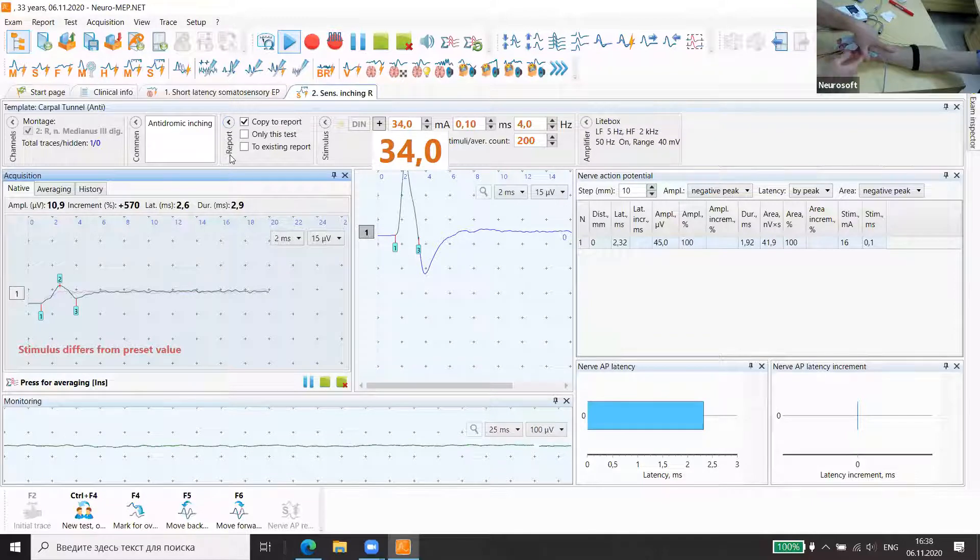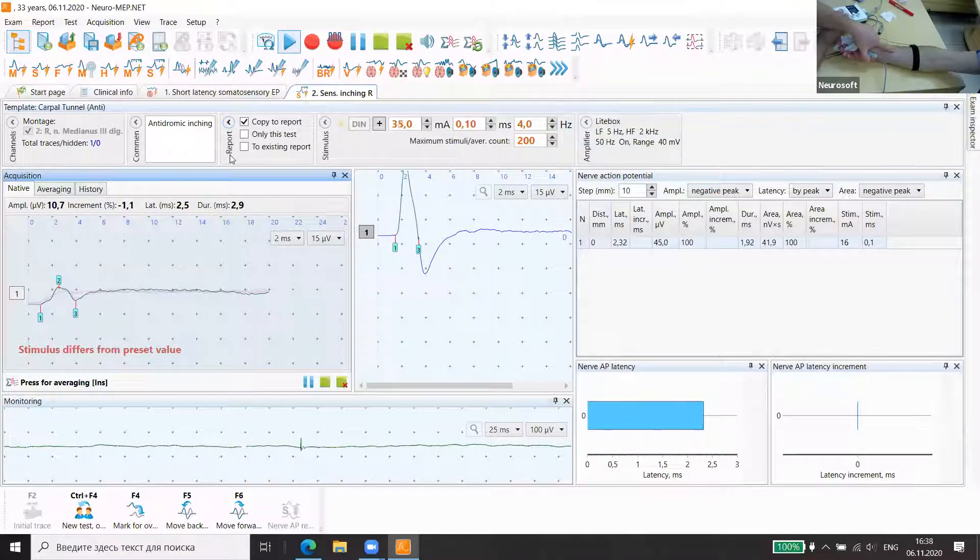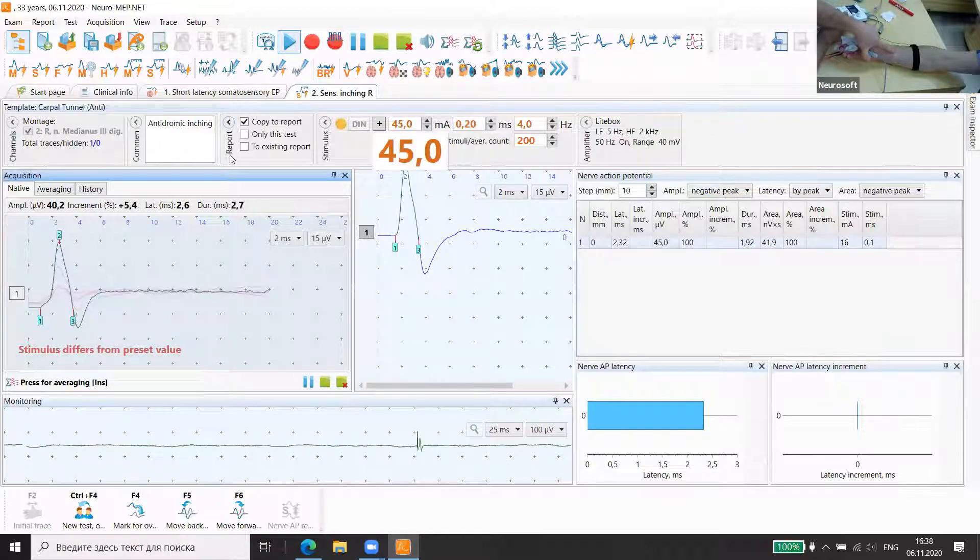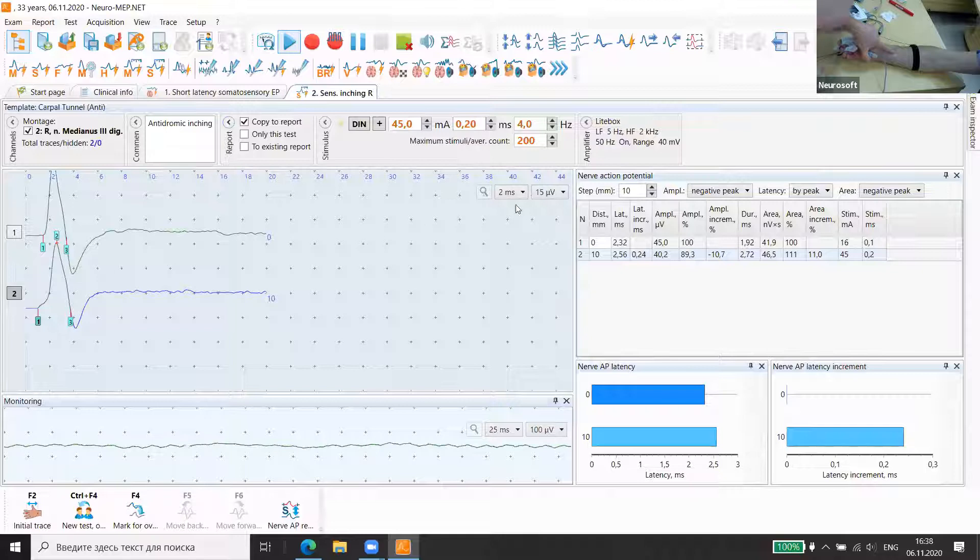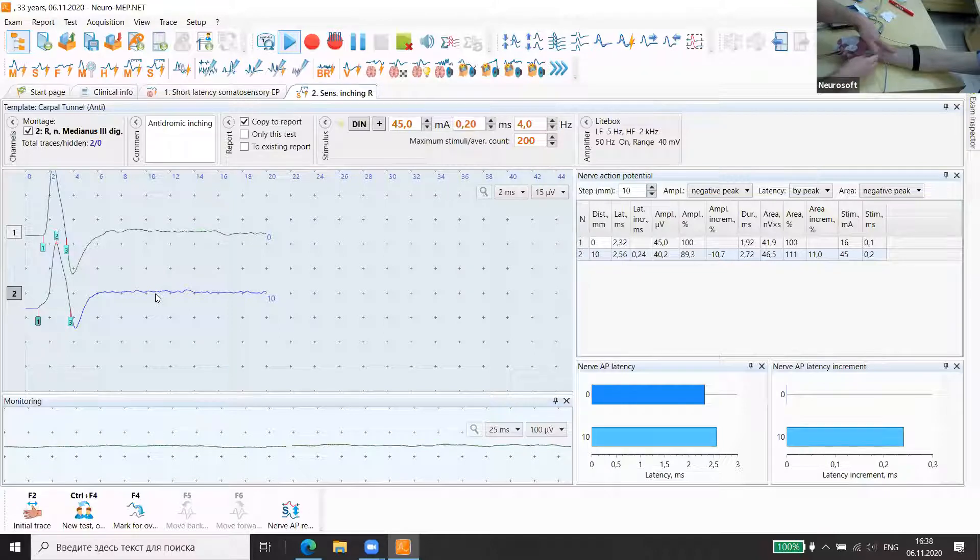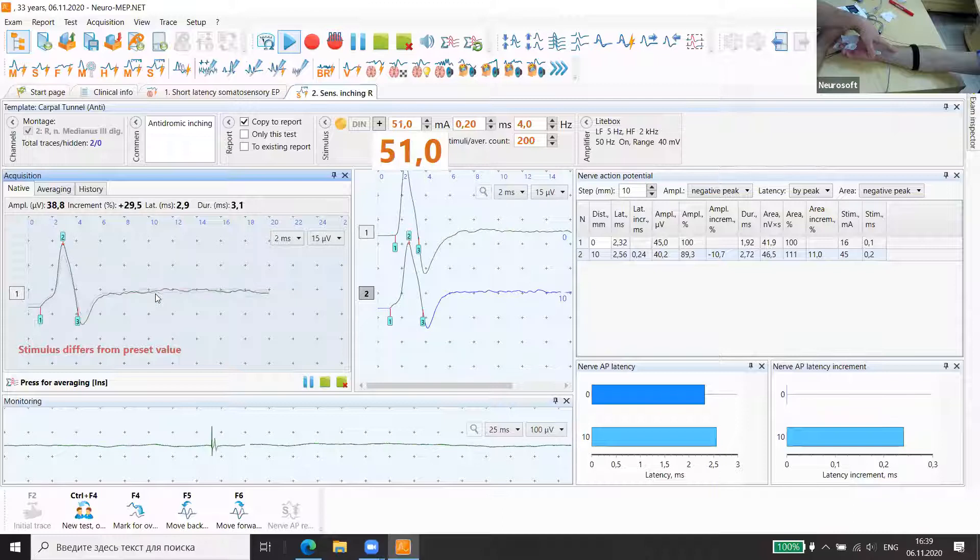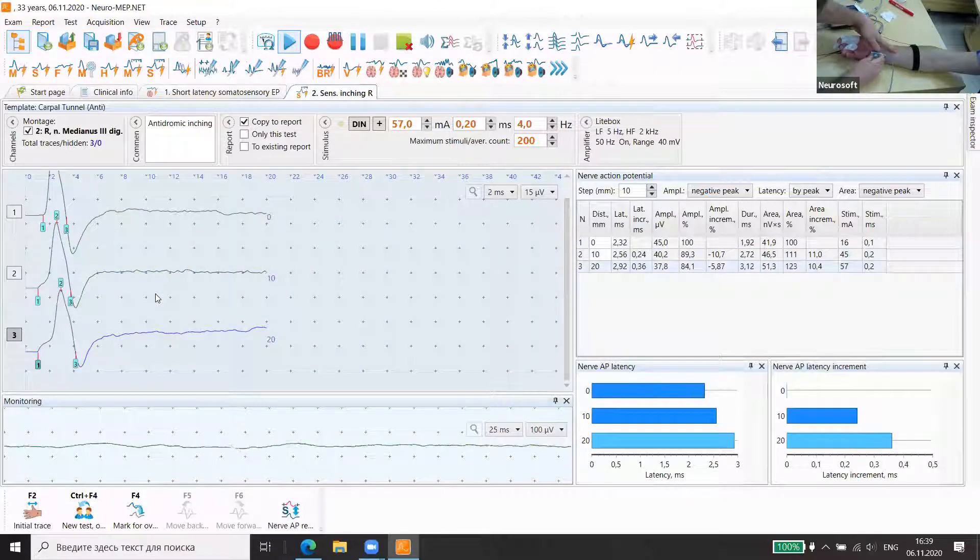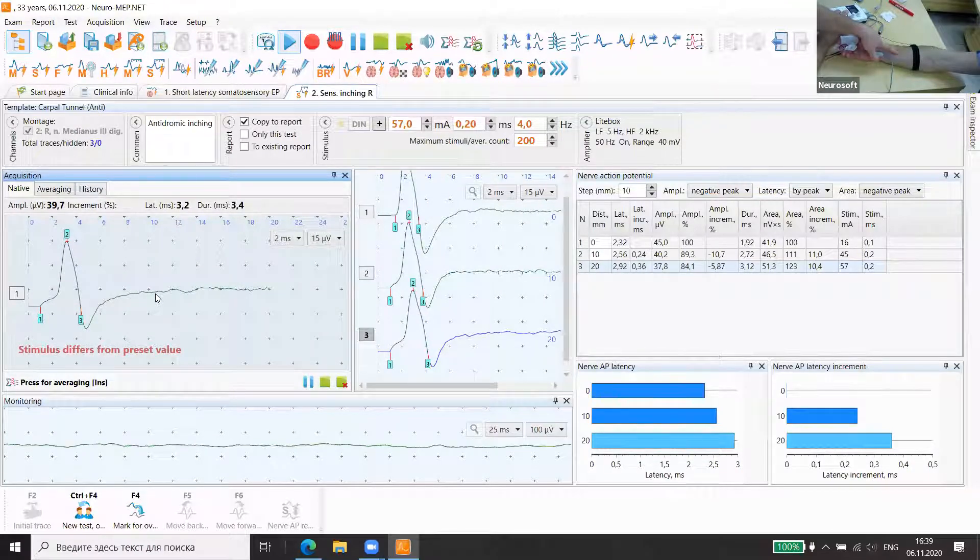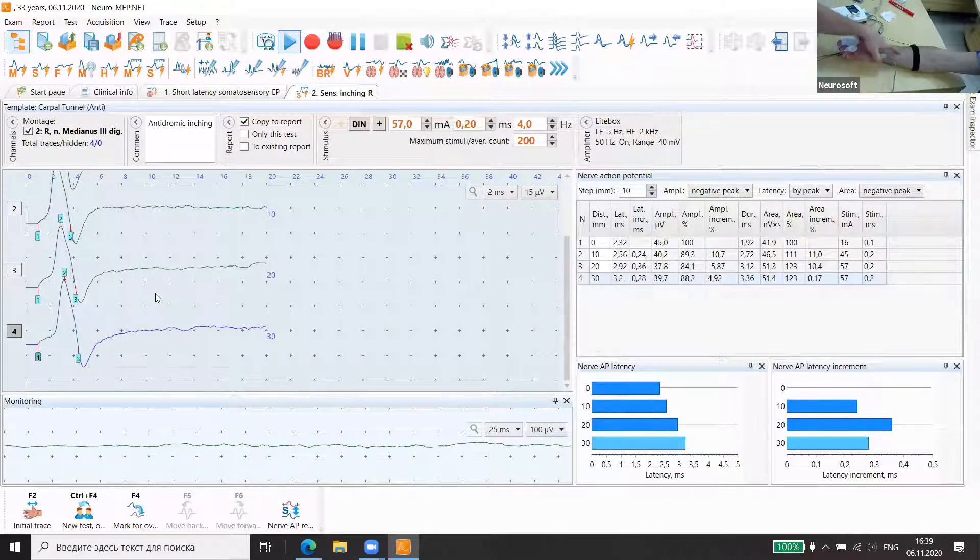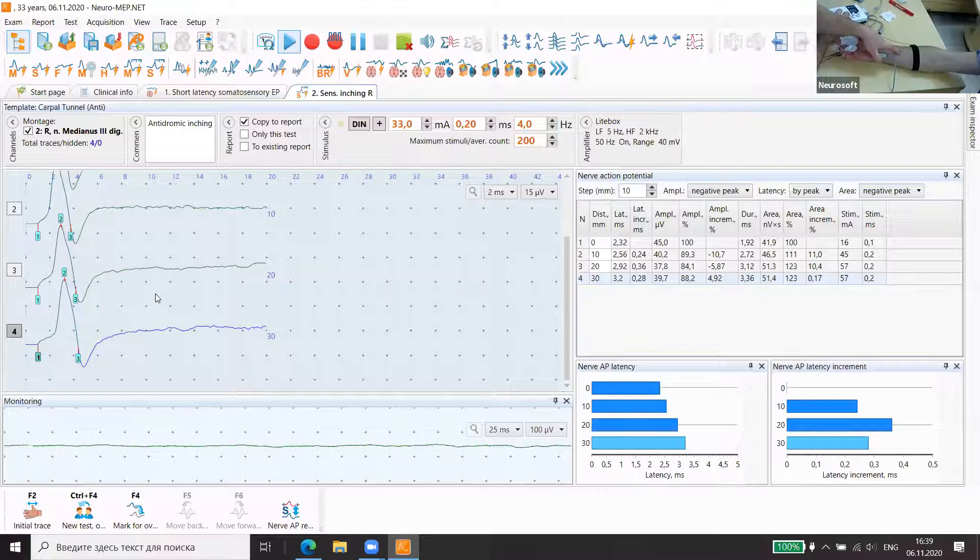We increase a little. At each level, the depth of the nerve is different, so we need to change intensity. In inching methods, we usually use peak latency because it's more accurate. Next point. Increased intensity. Next point. Here, already we can decrease the intensity because the nerve is closer to the surface.